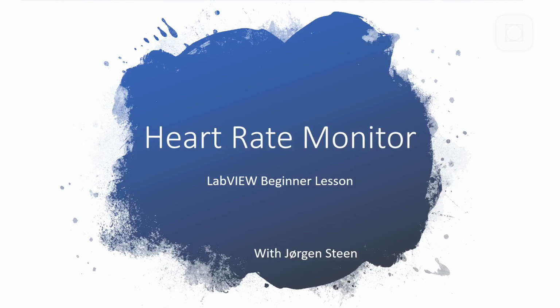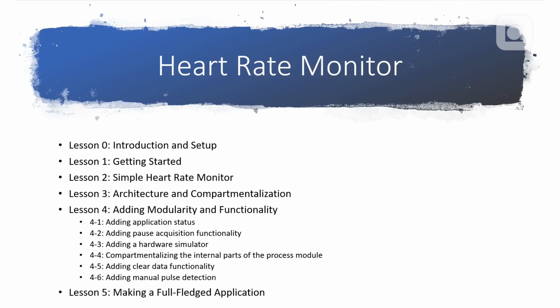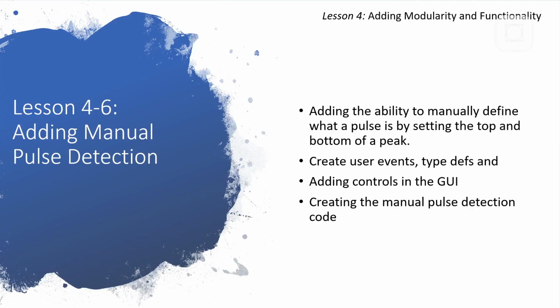This is a LabVIEW Beginner lesson where we make a heart rate monitor. This is lesson 4 where we add modularity and functionality. In lesson 4-6 we'll be adding manual pulse detection to our application.